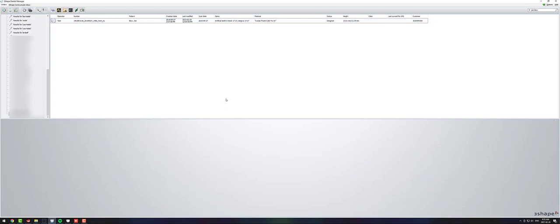I find it a lot faster than right clicking and trying to remember where it is. You can generate your cam output, you can export your case, you can open a new case.